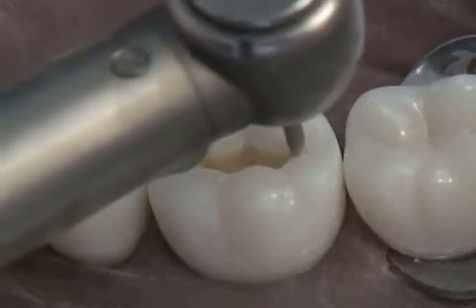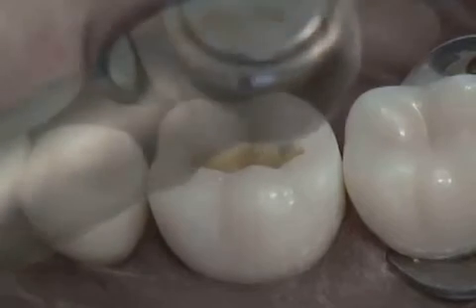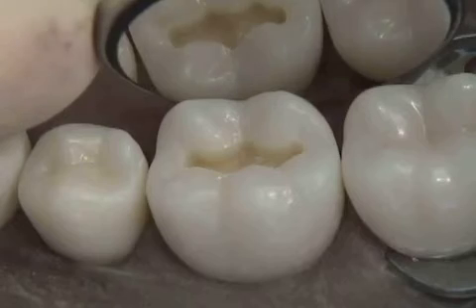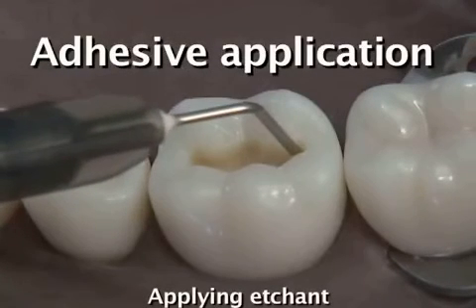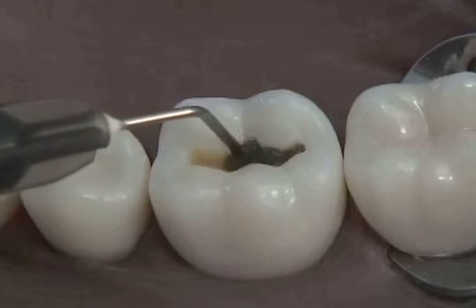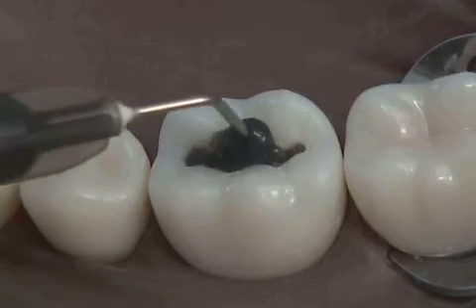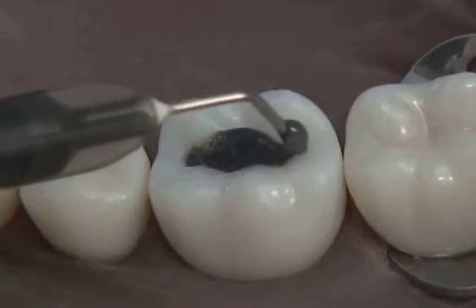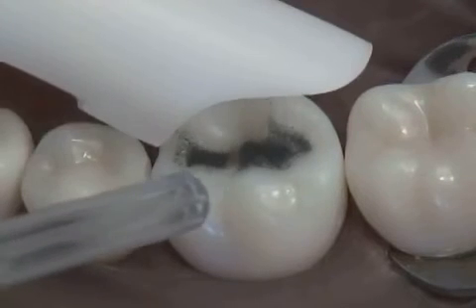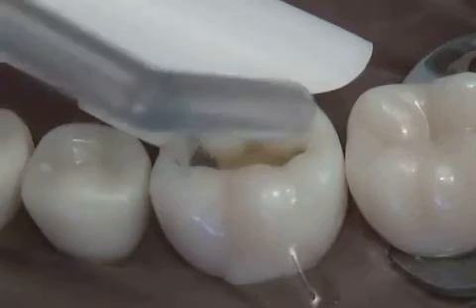You can roughen the enamel walls with a coarse diamond burr to increase surface area and improve retention of the composite material. Apply 30 to 40% phosphoric acid etch to the entire preparation to clean off surface debris and remove the smear layer of dentin. Let it sit for about 15 to 20 seconds. Remove it thoroughly with water and high volume suction.